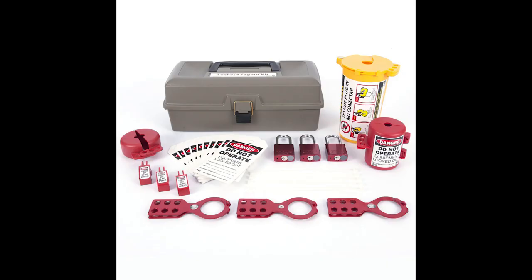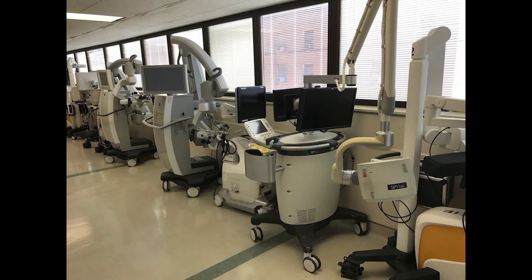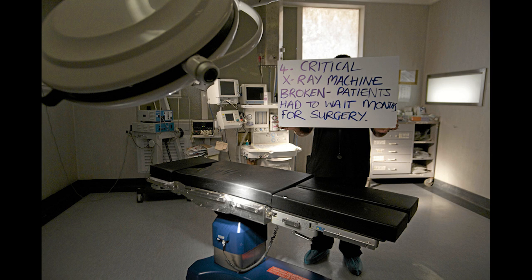If an item is not able to be secured in a shop, make sure it's locked out with the lockout tagout kit, tagged with specifics, and documented in the lockout binder. Equipment ending up back in service prematurely puts the patient and users at risk, not to mention the wasted man hours on inventory sweeps, extra paperwork, incident reports, and remedial training. Tag your equipment correctly and ensure that users are trained to fulfill their obligation to the equipment reporting process.